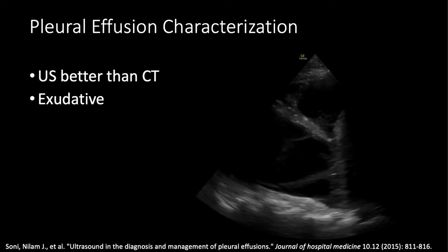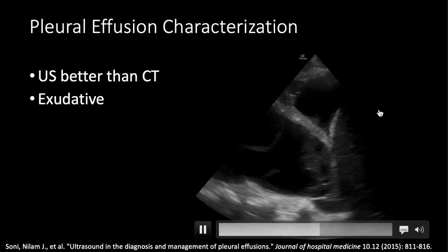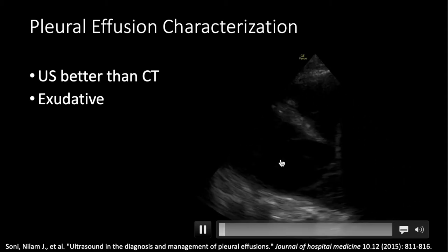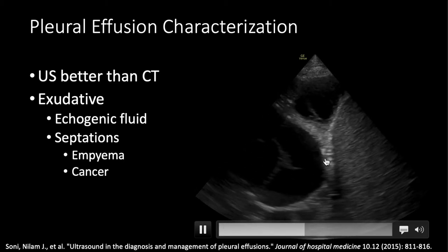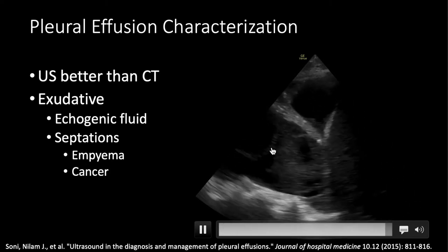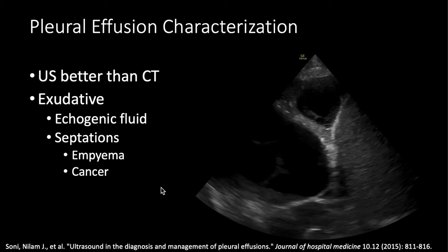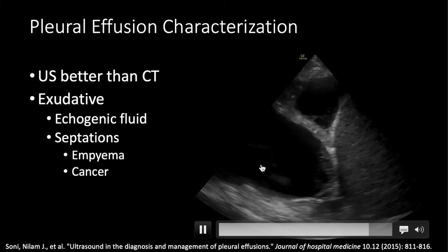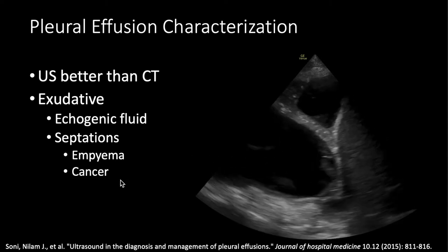Ultrasound is much better than CT at characterizing pleural effusions. Here we have a spine sign — something in the thoracic cavity is transmitting sound waves very well — and we can see echogenic fluid and septations. These thick septations, when you see them, indicate either empyema or cancer very often, definitely requiring a diagnostic thoracentesis. Ultrasound can see these septations much better than CT, whose slices may only be half a centimeter thick and can't resolve these fine structures most of the time.